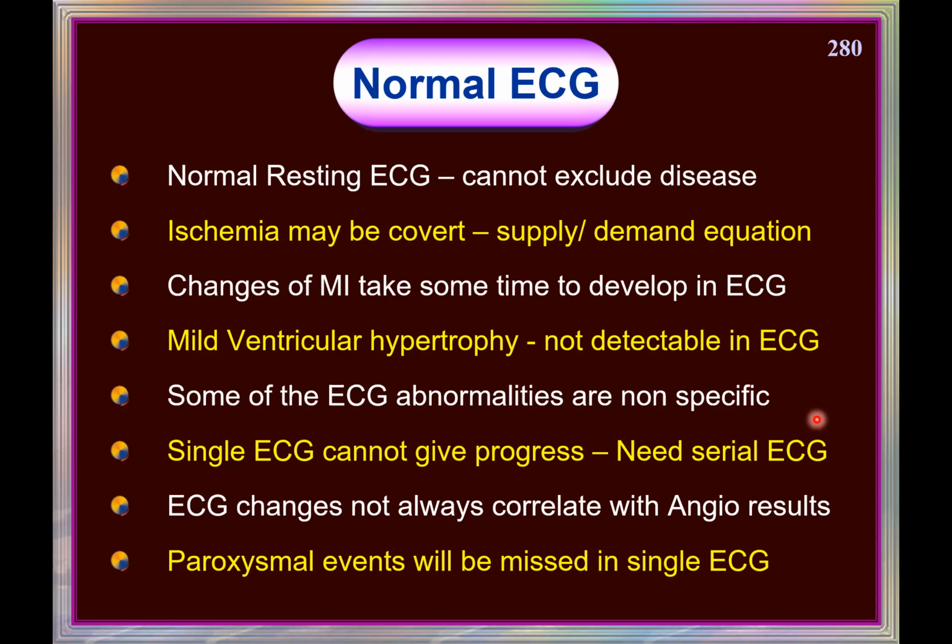It is not static. Sometimes there may be dynamic occlusion, sometimes permanent occlusion, sometimes incomplete occlusion. All those are brought out by angiocardiography.